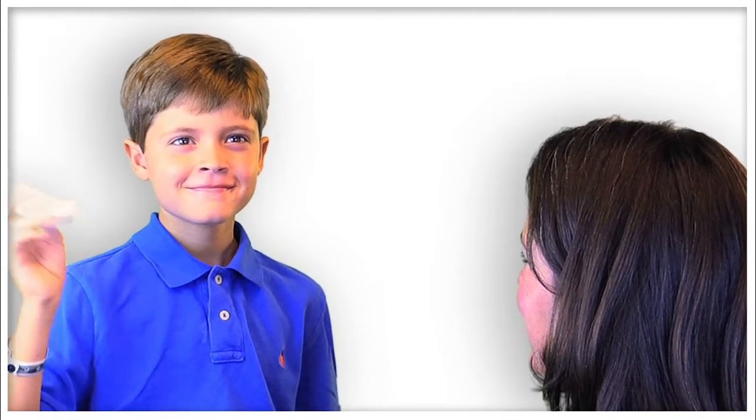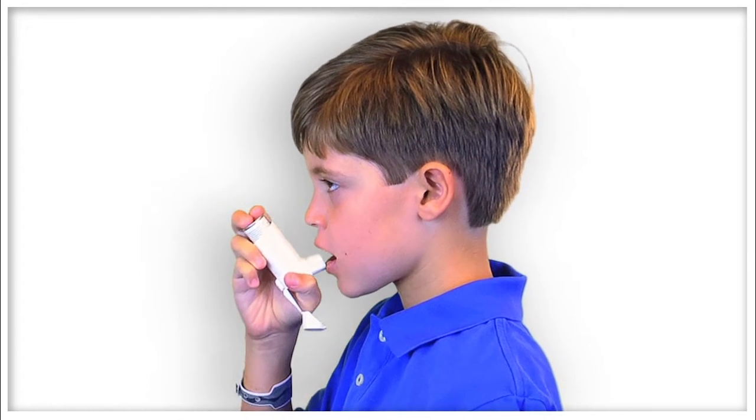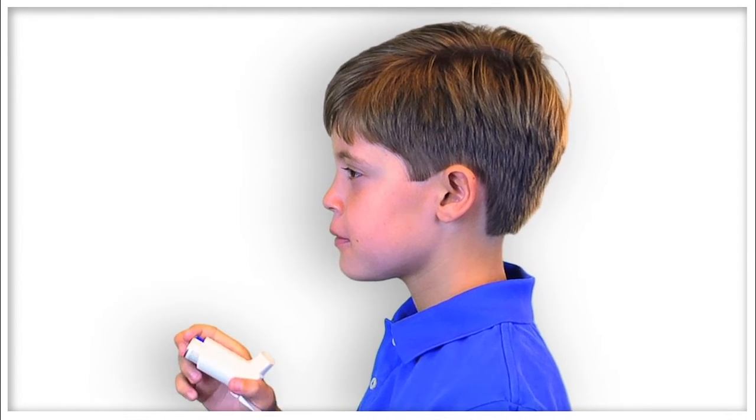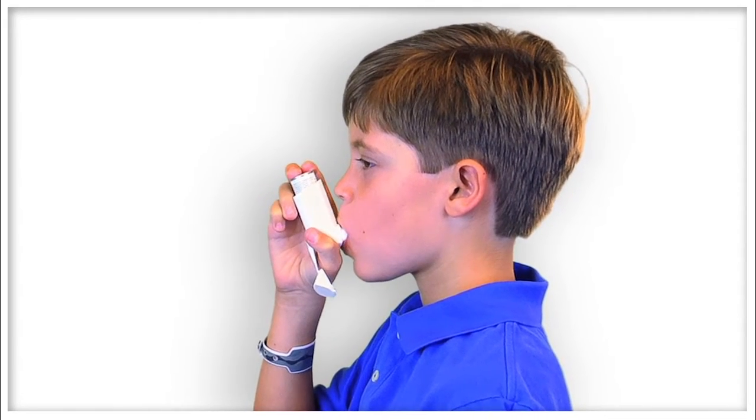The first step is to shake the inhaler for 15 seconds before using it. You should then remove the cap from the mouthpiece. It's important that you do not attach a spacer to the mouthpiece. The next step is to take a breath in and out and then close your mouth around the mouthpiece, sealing your lips.